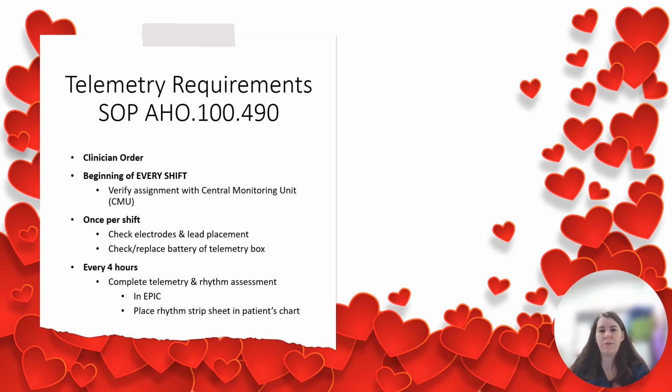So our telemetry requirements, we do have an SOP. It's AHO.100.490, which lays out very nicely everything that we need to do for our patients that are on telemetry. First and foremost, we need an order from a physician, a midwife. We need a practitioner level order.